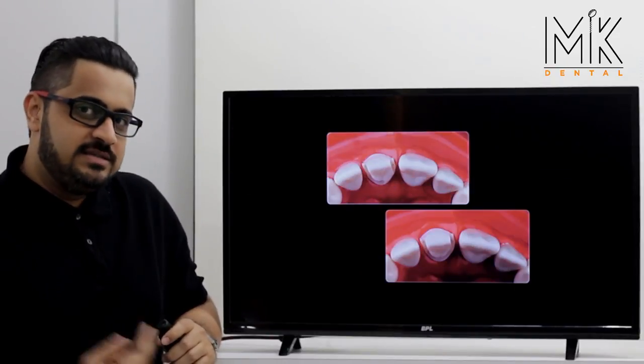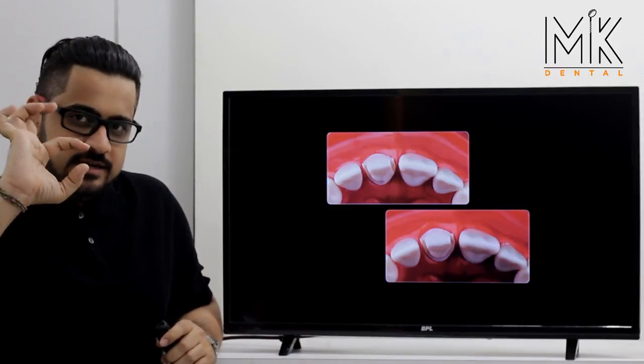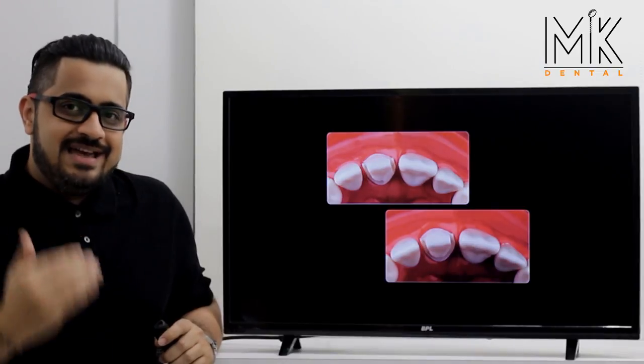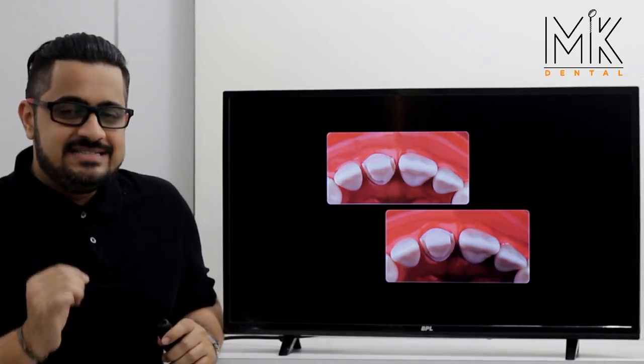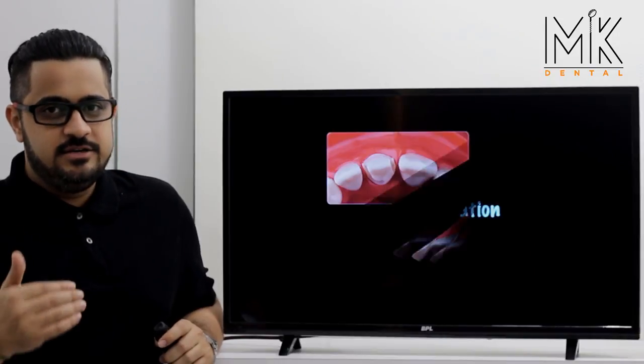Reduce the entire palatal margin towards the mesial and towards the distal. What you've done is create a definite vertical column of tooth structure that will provide for resistance form.